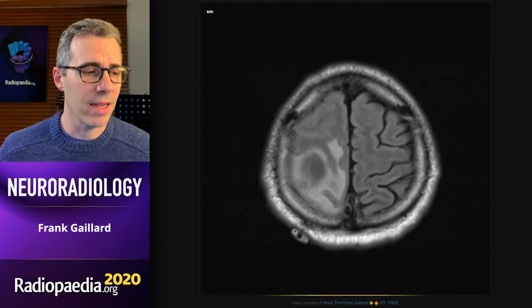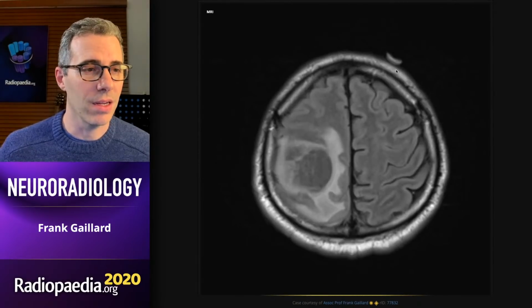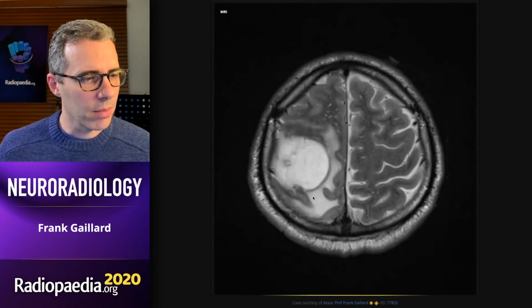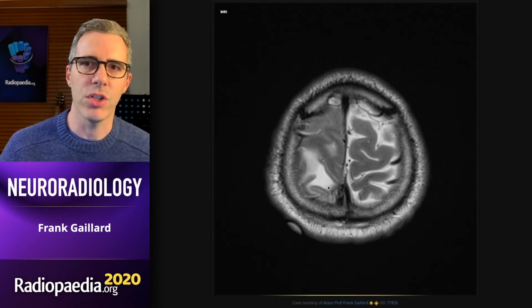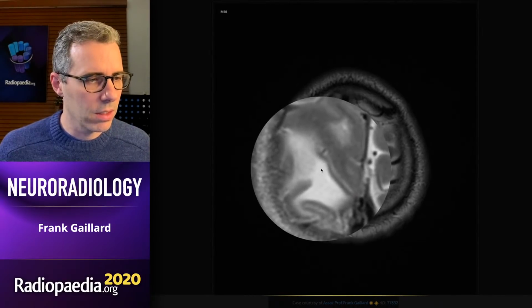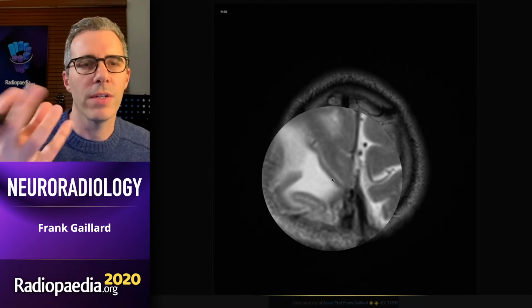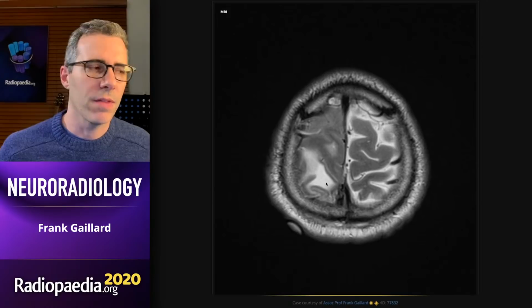Quick clue here, if you're in any exams and you ever see these on the skull, that means someone, at least on the basis of CT, thought that they were going to operate, because these are fiducials for stereotaxis. So let's have a look at this area of edema up here, because I think this is a nice example of just how bright vasogenic edema can get. Perfectly spares the cortex. It washes up against the cortex and stops. The cortex is normal in thickness. It's maybe a little bit stretched because the gyrus is expanded. And the signal intensity of this area is almost CSF-like.